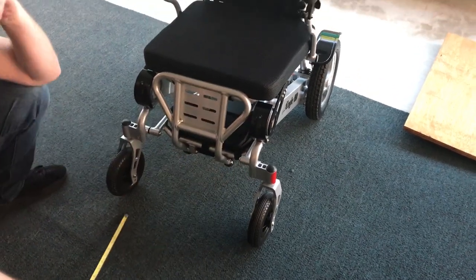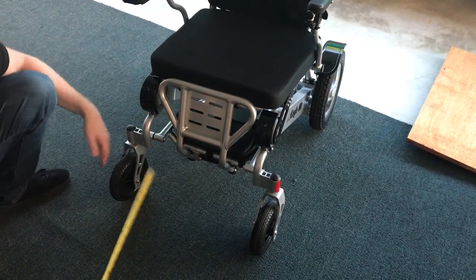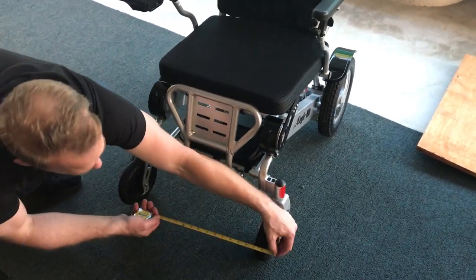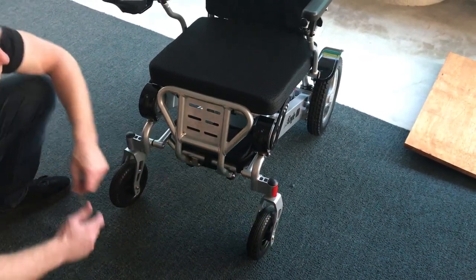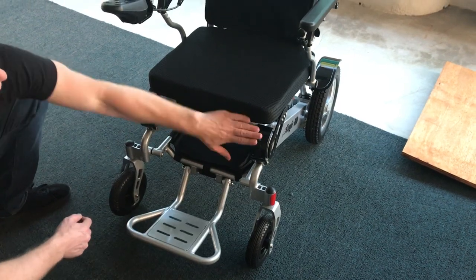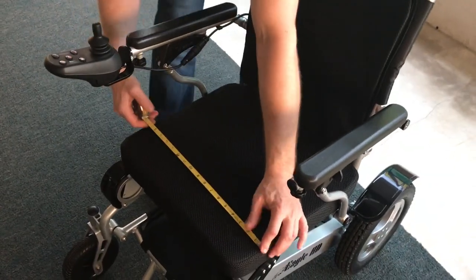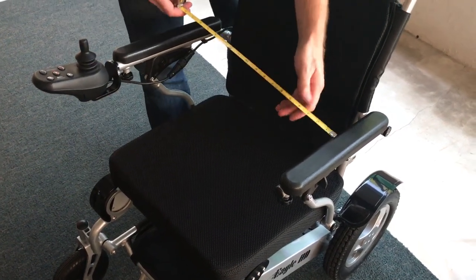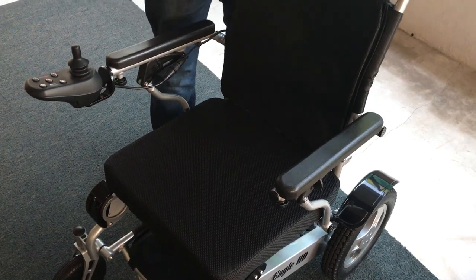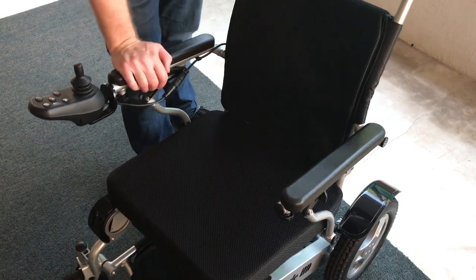The footrest folds totally flush to the chair itself, so for a person who needs that extra space this is a great option. From the outside of one wheel to the outside of the other wheel we're at 22 inches. The batteries are in the handles and fold right out. Working up to the seat width, we're at 17 and a half inches wide across the seat, and about 18 and a half to 19 inches wide in the seating area.